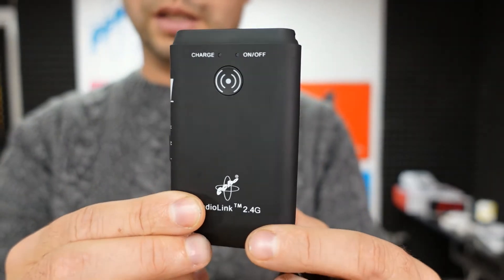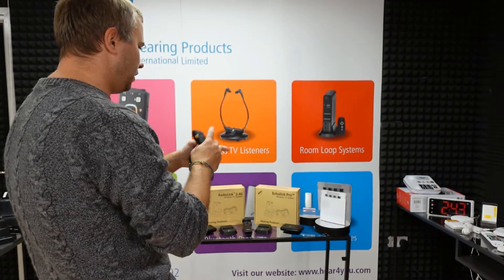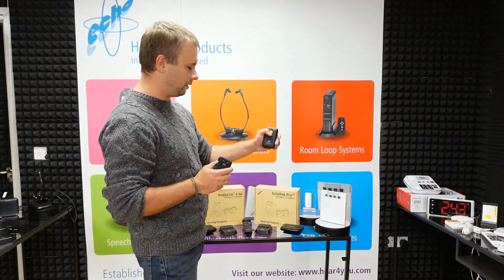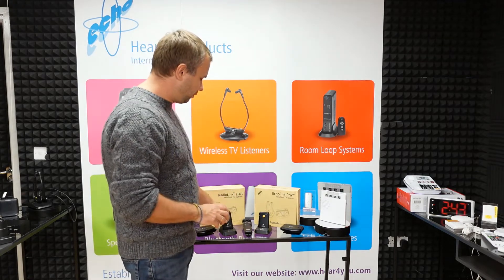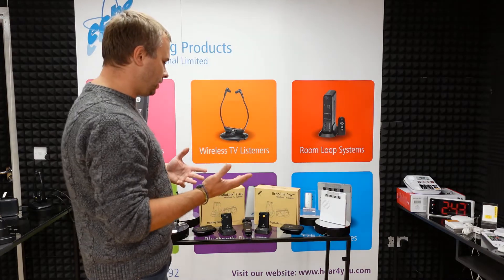Echolink is slightly cheaper because infrared technology is slightly cheaper than RadioLink 2.4G. The connections are the same on both units.